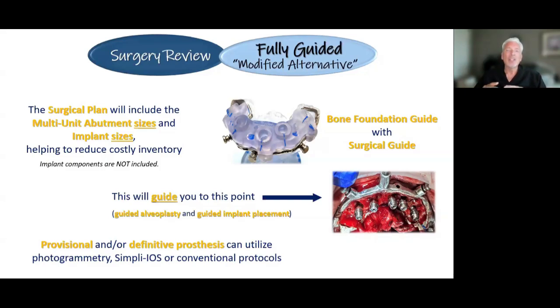So having really precise bone reduction is a real benefit to your restorative doctor, because that makes sure the laboratory is getting the adequate amount of intra-arch space for whatever type of prosthesis your restorative doctor is looking for the patient. We know that, say, denture teeth in acrylic with a titanium bar requires more inter-arch restorative space than, say, a zirconia full arch.